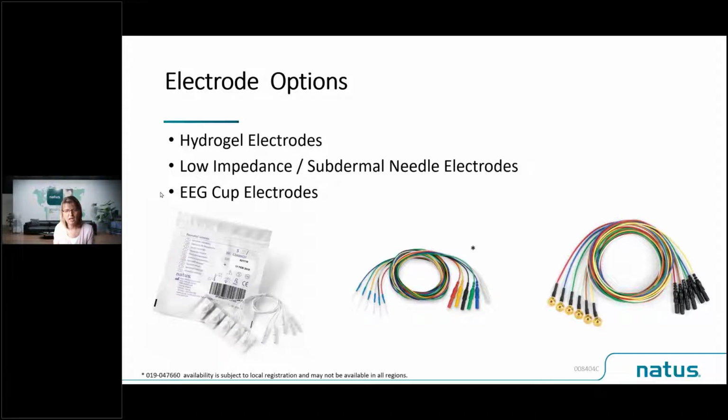All of these things are things that we will consider when we choose the specific electrode for each individual baby. What we also need to consider, when we think about hydrogel electrodes, is that they generally remain effective for up to about 24 hours without need for intervention. But they do require quite assertive preparation, and you may need to rehydrate them during use.